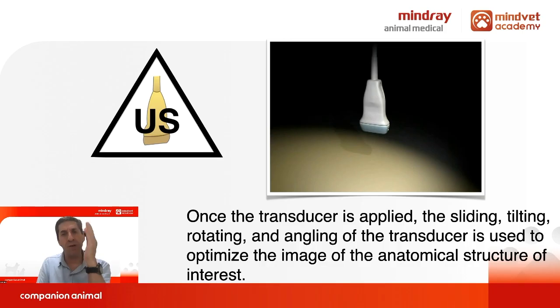For that reason, the ultrasound beam should always be perpendicular to the skin. So use tilt, for instance, to enhance the image, to realize the position of the nerve or structure you are looking for.